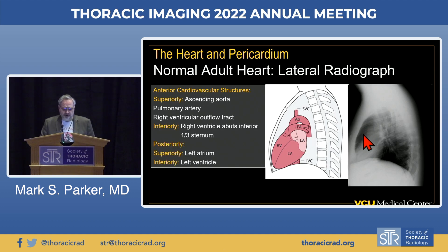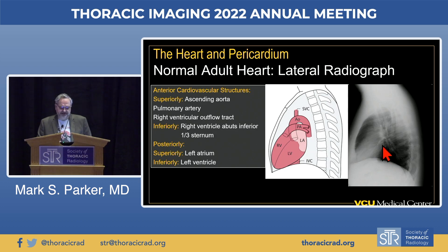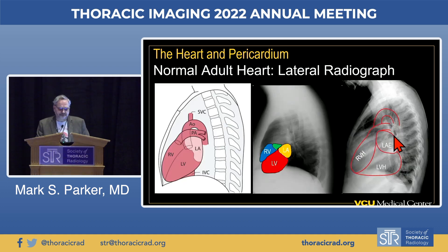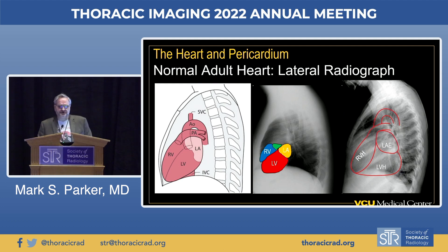Posteriorly, the superior posterior border is created by the left atrium, and the inferior border by the left ventricle. The space between the myocardium and the spine is referred to as the retrocardiac clear space. Knowledge of the shape and morphology of these chambers is very helpful for recognizing single or multi-chamber enlargement on a lateral chest radiograph.